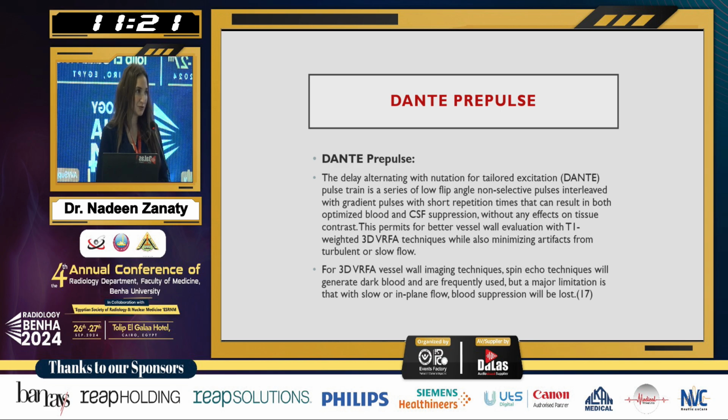What it actually does, without entering too much into physics, is just suppress the CSF and suppress the blood signal without causing any noise or any artifact on the tissue itself. So it was really perfect.